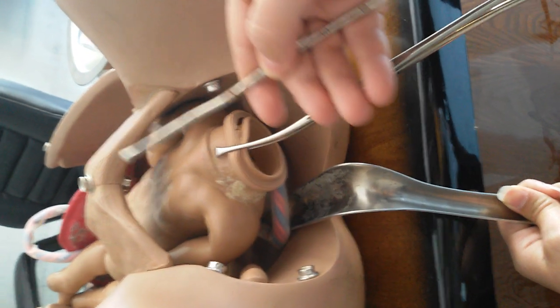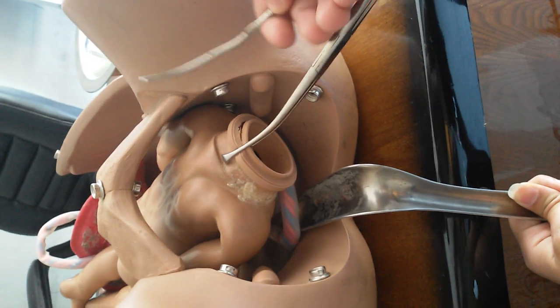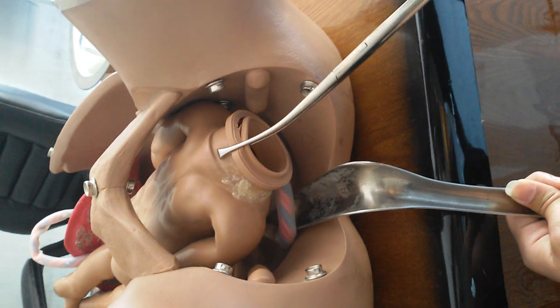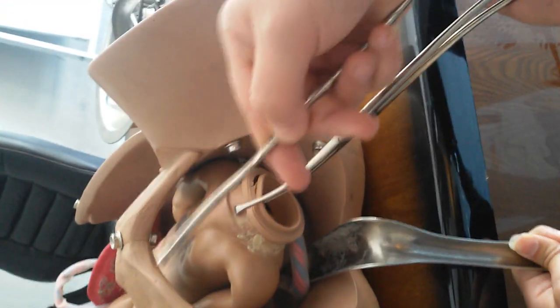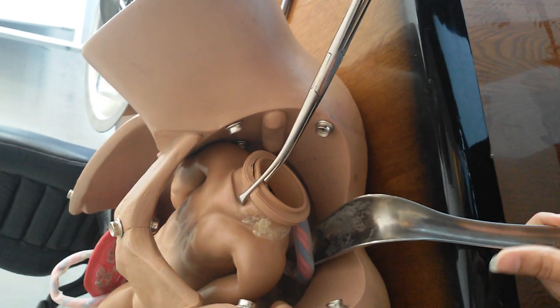The measurement here is about eight centimeters. If it is eight centimeters, it means the gestational age is eight weeks. We then compare every instrument we are going to use next against this measurement — for example, the sponge forceps — and we mark that it is about eight centimeters.